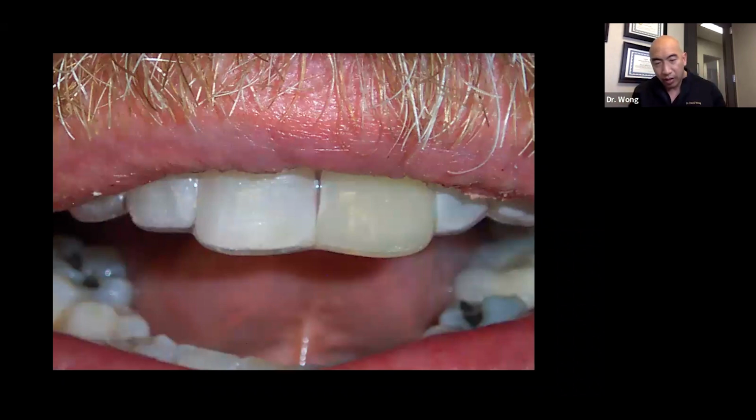You're going to close out with the figure 8 suture, and you're going to provisionalize, preferably with an Essex retainer. I say preferably because Essex retainers are tooth-borne, so they don't put any pressure on the tissue at all, which is great. The most common thing I see is a flipper partial, which is fine as well, but you've got to make sure that you relieve the area above that's sitting on the graft. You don't really want any pressure on it. And you also want to make sure that you relieve the papilla area so it's not pushing the papilla down.